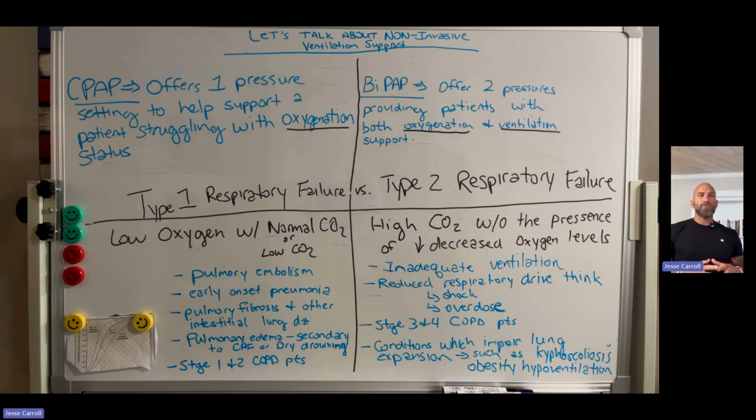So that being said, this was just a quick video that I wanted to do for you guys to help you decipher when you want to decide on using CPAP versus BiPAP. And if you don't use BiPAP in your agency yet, you definitely want to get connected with your logistics team or your clinical education team and start looking into the options that are out there for devices that actually offer BiPAP.